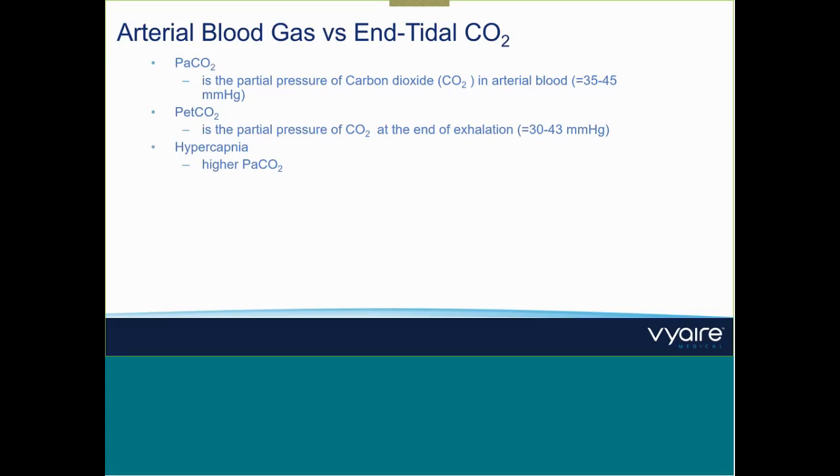The other way around is hypocapnia, and that happens when you hyperventilate the patient and just eliminate on a higher level. And the patients are only hypo or hyperventilated when it somehow affects the CO2. I've come across, for many years, sites where they say the patient is hypoventilated or hyperventilated just because of the respiratory rate. When there's a high respiratory rate and the CO2 is normal, the patient is not hyper or hypoventilated. So as long as the CO2 is normal, as long as there is no hyper or hypocapnia, whatever the respiratory rate is, it's not hyper or hypoventilated.